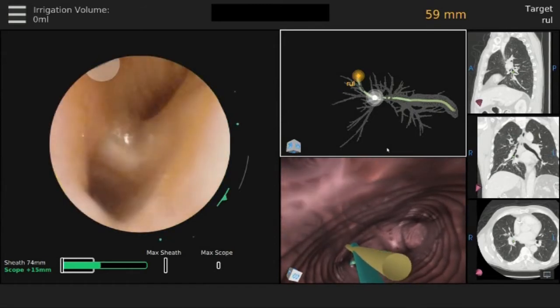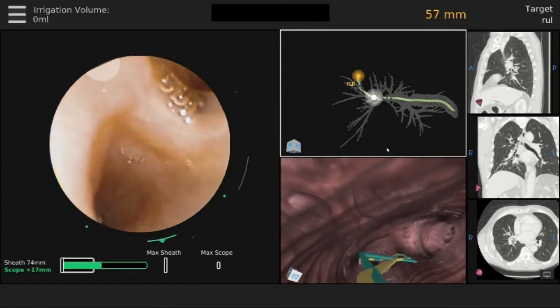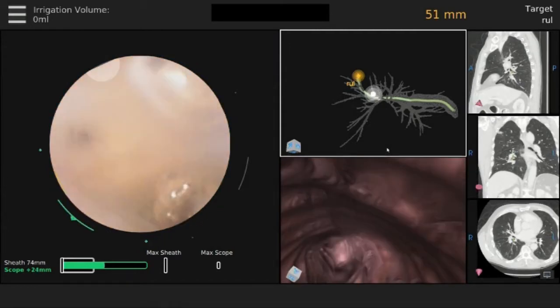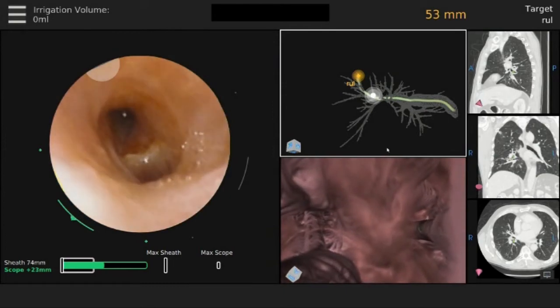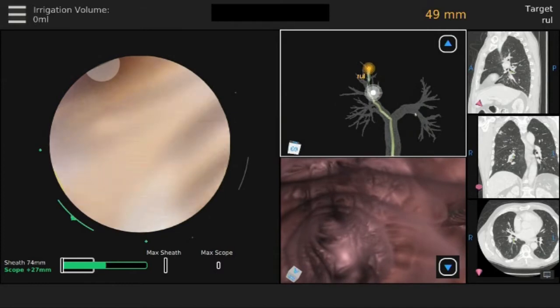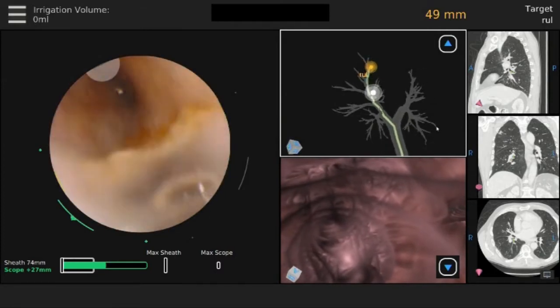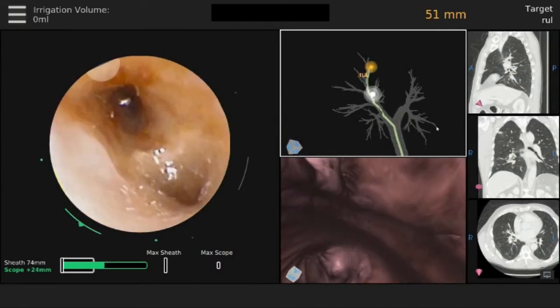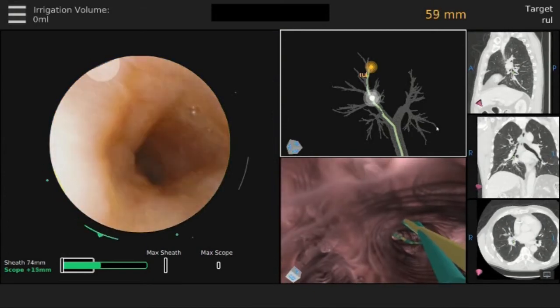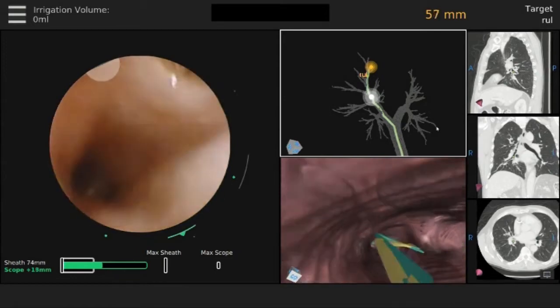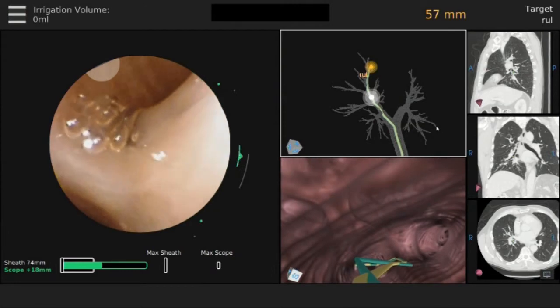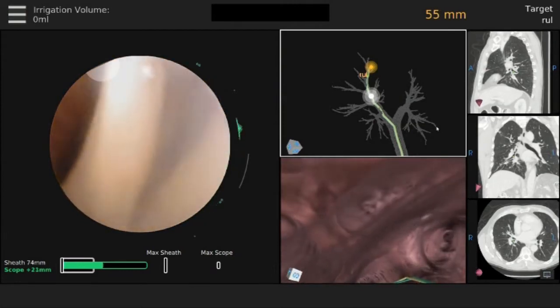An advantage of robotic-assisted bronchoscopy is the ability to navigate the bronchoscope under direct vision through more peripheral airways. There is the ability to rotate the virtual image to provide additional guidance while navigating towards the target lesion. The precision of the robotic control, as well as maintaining direct visualization, allows a degree of precision not previously possible with standard bronchoscopy.